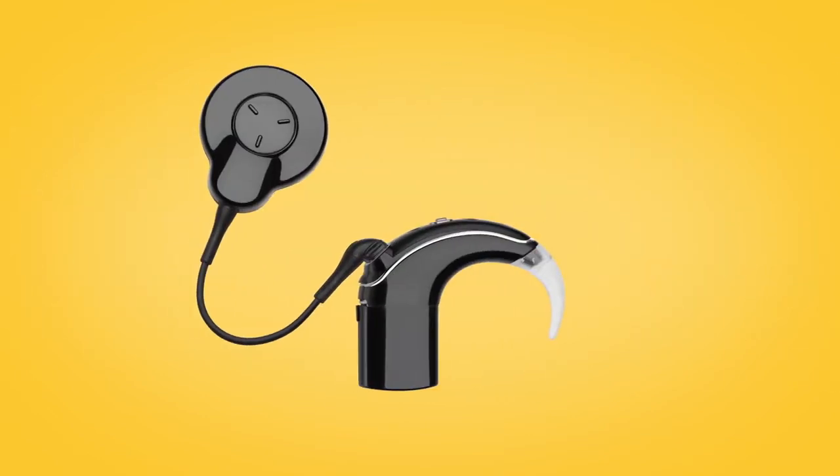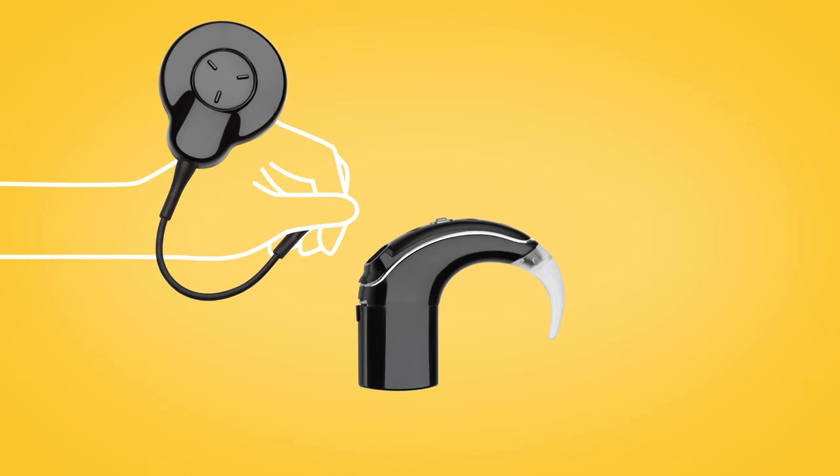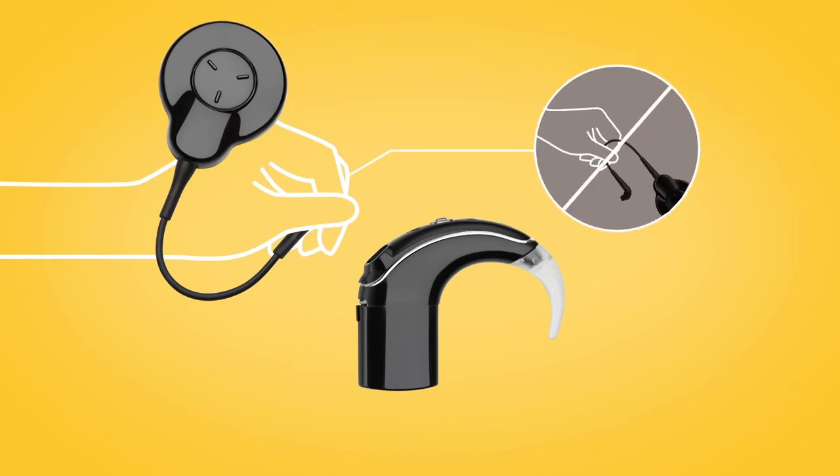First, you need to remove the old microphone cover. Hold the coil cable grip and firmly pull it straight out of the sound processor. Do not tug on the flexible part of the coil cable, and be careful not to twist the coil cable when you pull it out.